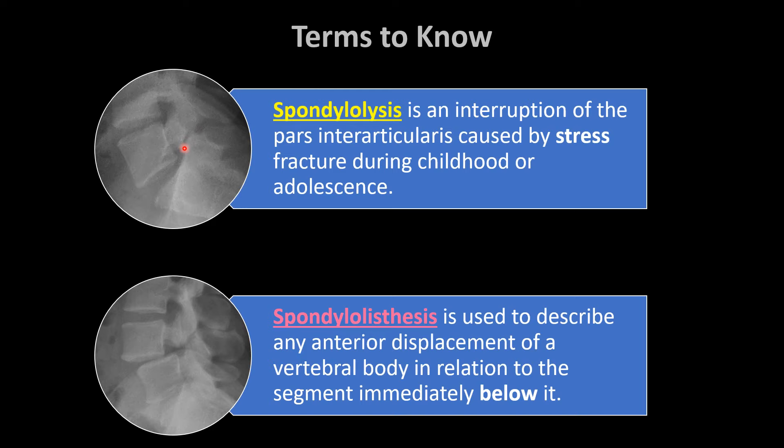Spondylolisthesis is a term used to describe any anterior translation or displacement of a vertebral body in relation to the segment immediately below it. In this case we have a spondylolysis with anterolisthesis. Here you can see L4 in relation to L5, so this is a spondylolisthesis of L4 because it has moved anterior in relation to L5.